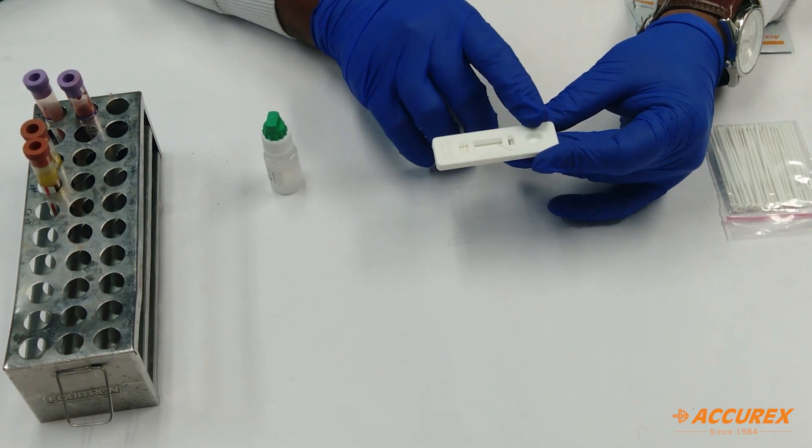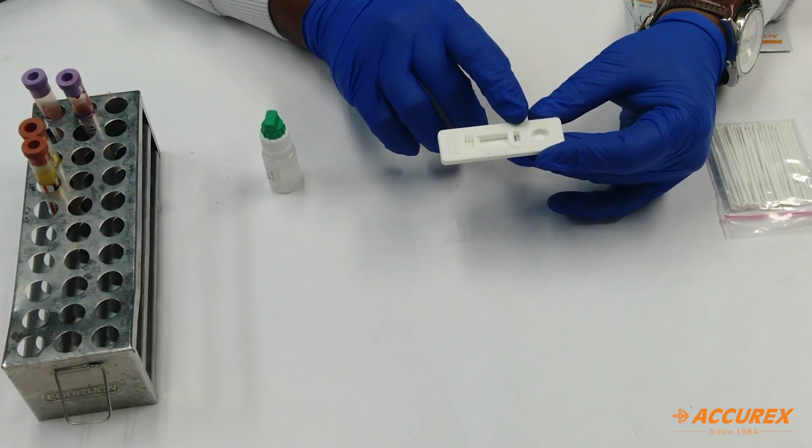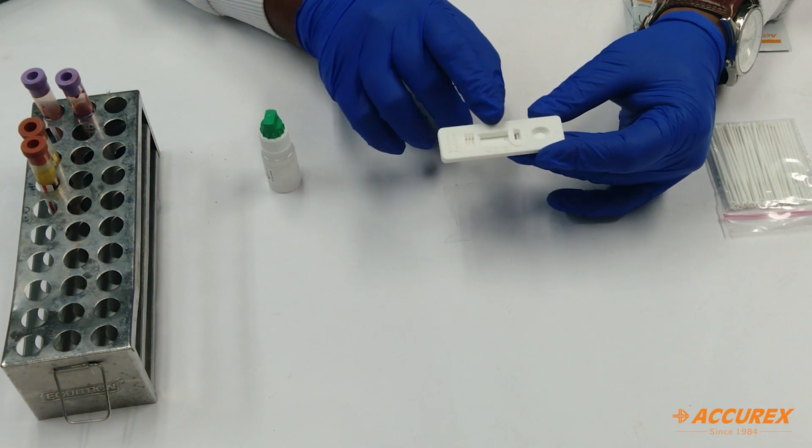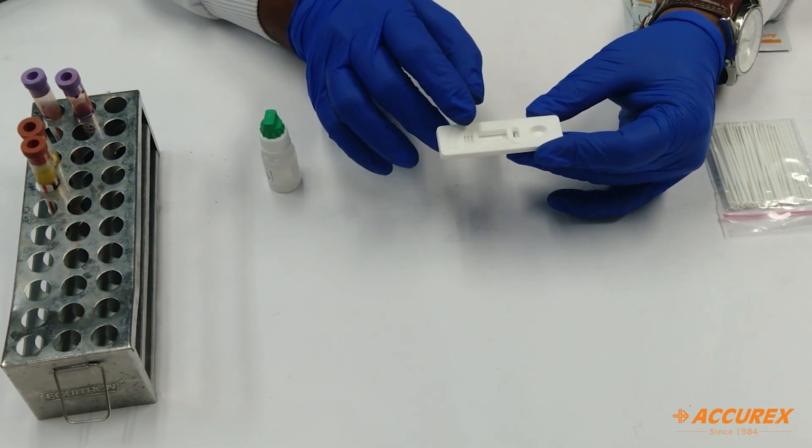The first window is for the buffer. Second is for the sample. You can add whole blood sample over here. Third window is where you can find the results for the Plasmodium falciparum, Plasmodium vivax and the control line.